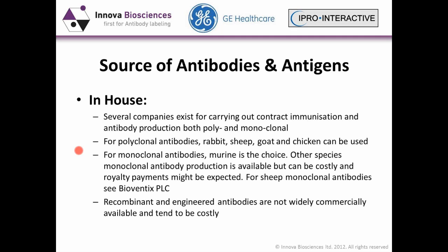For polyclonal antibodies, there's a very wide choice of species one can use. Recently, many people say that chicken antibodies would be very good to use because they lack complement fixation. However, there are other problems that can be involved with using chicken antibodies.